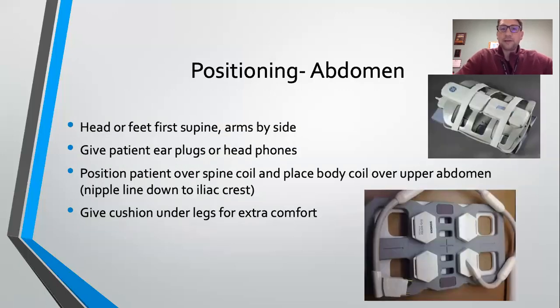All right, positioning. Most of the time they're going to be supine. You have the luxury of doing these head or feet first, so depending on if they're claustrophobic or not, you can adjust. You're going to give them the headphones because you're going to be doing breathing commands. Don't forget the headphones. You have to tell them when to breathe and when to stop breathing.